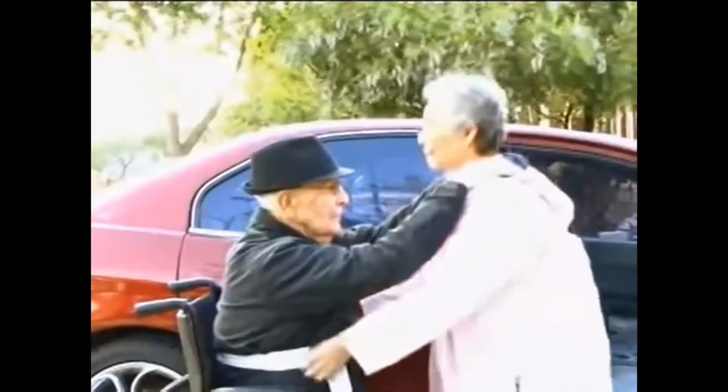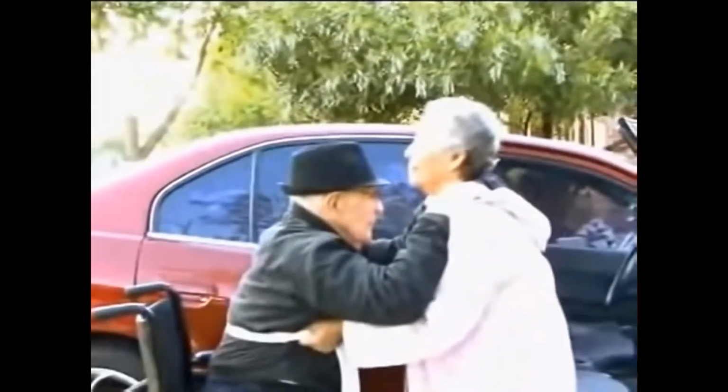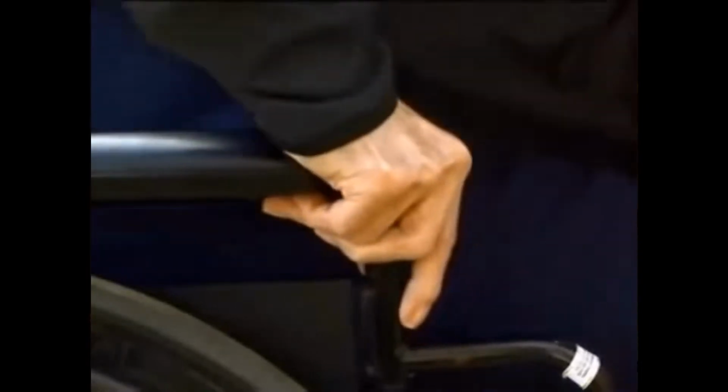Leaning forward shifts the person's weight forward over their feet and will make it easier for them to stand and transfer. To prevent you or the individual from being injured, you should avoid having them hold on to you. Instead, you should have them place their hands on the armrests of the wheelchair and push up. Get a good grip on the gait belt and help them to stand.